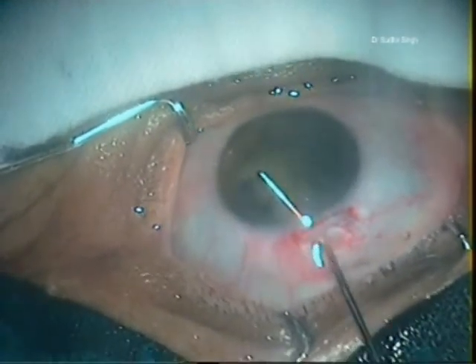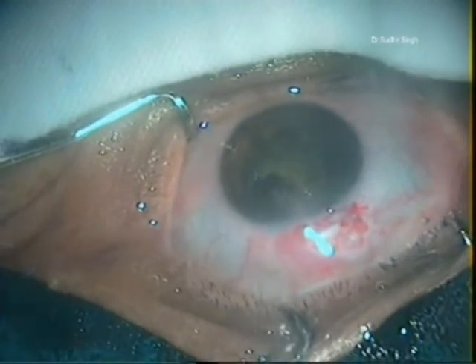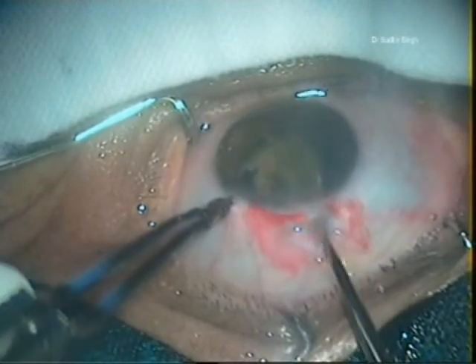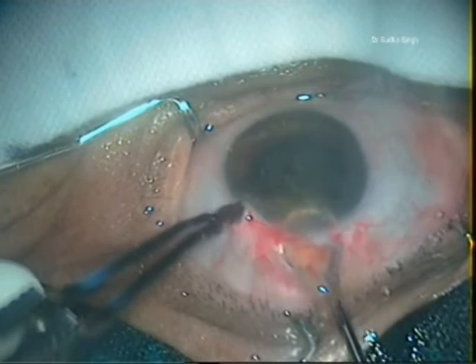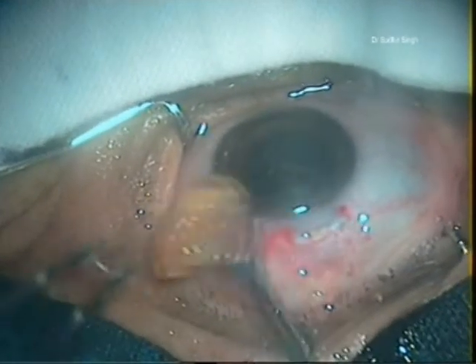With viscoelastic, the engaged part of the nucleus is pushed back into the anterior chamber and rotated so its longitudinal axis coincides with the longitudinal axis of the tunnel. The remaining part of the nucleus is engaged in the vectis and slowly taken out while the posterior lip of the tunnel is depressed.